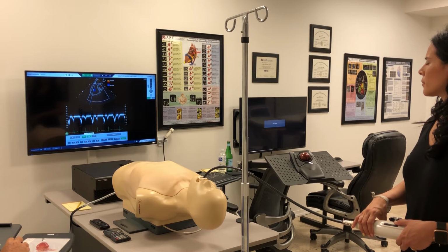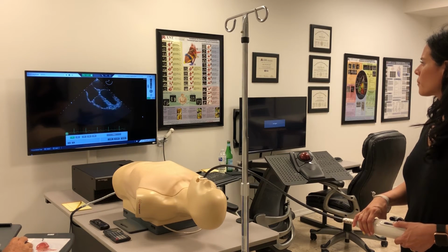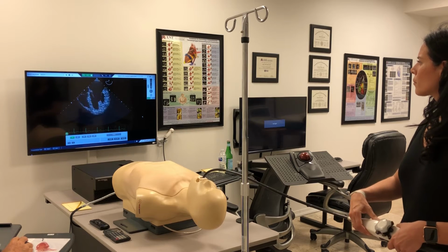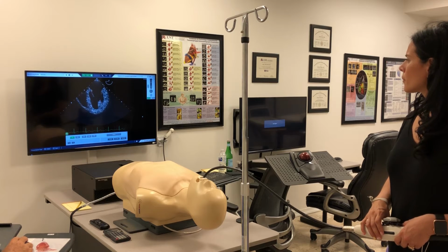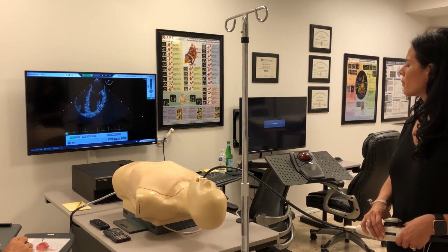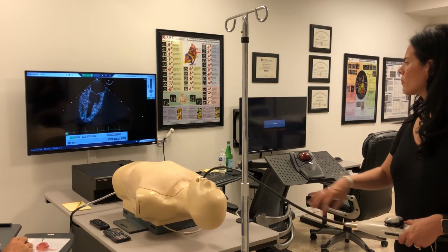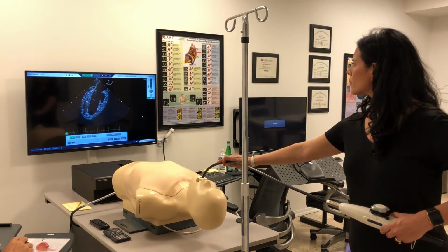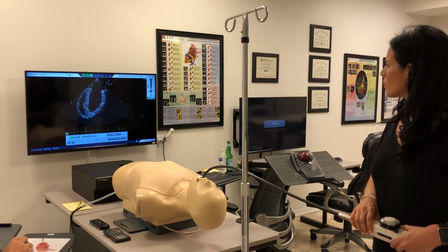Good. Now let's go on and develop the left atrial appendage view. So let me turn this off and we'll go back to the home view at 0 degrees, and we'll find a nice full left atria, which is centered in the screen. Good. Now the appendage will usually be found between 45 and 90 degrees. So you can quickly omniplane up to 45 degrees and then slowly advance until you develop a nice full appendage. You don't really want to turn the probe or advance the probe, but rather just advance the omniplane.